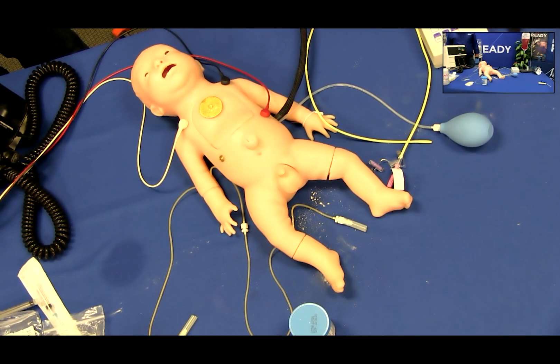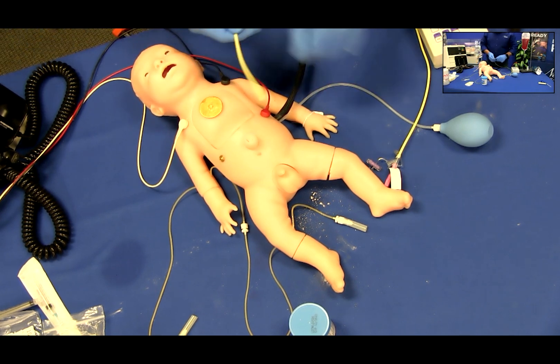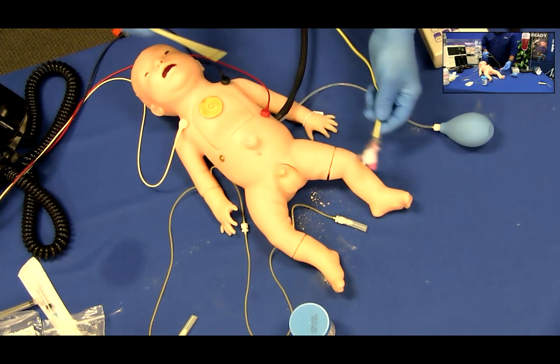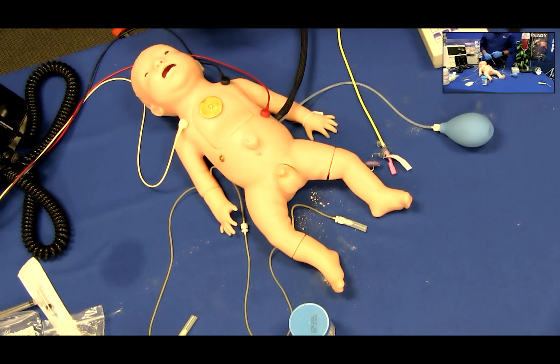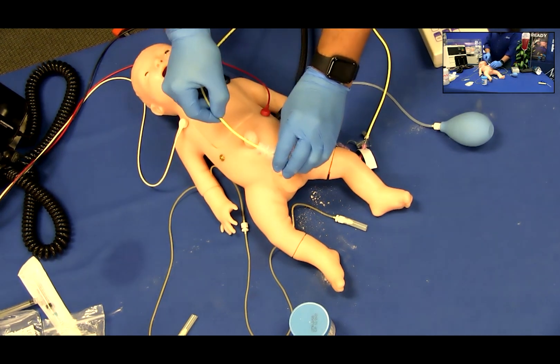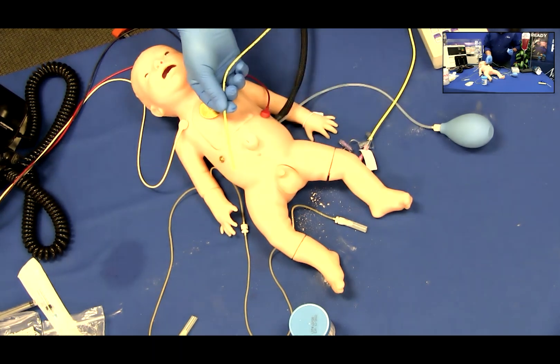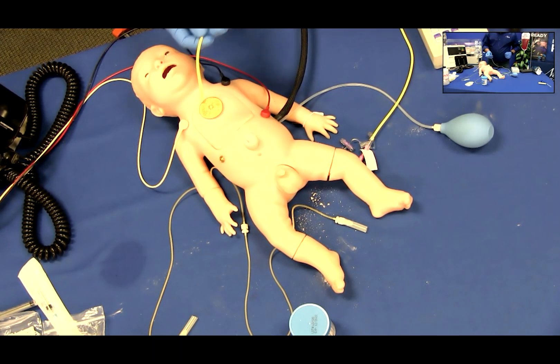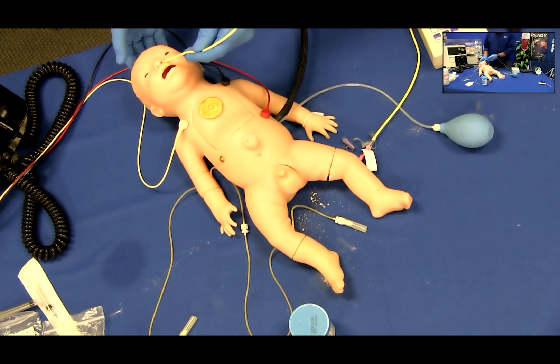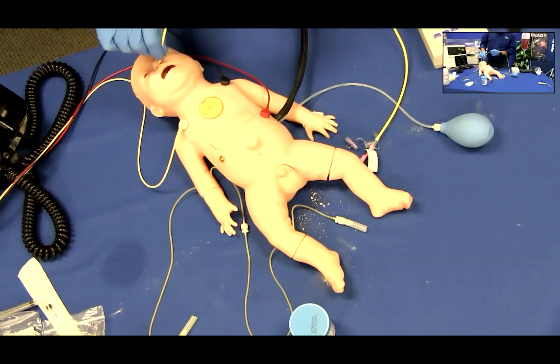Placing the NG tube. Charlie's left nostril may be used to practice NG tube insertion and care, with tube placement only and no fluids recommended. Generously lubricate the recommended 8 French NG tube with the lubricant provided. Feed the NG tube through the left nostril and follow general practice guidelines to place the tube.